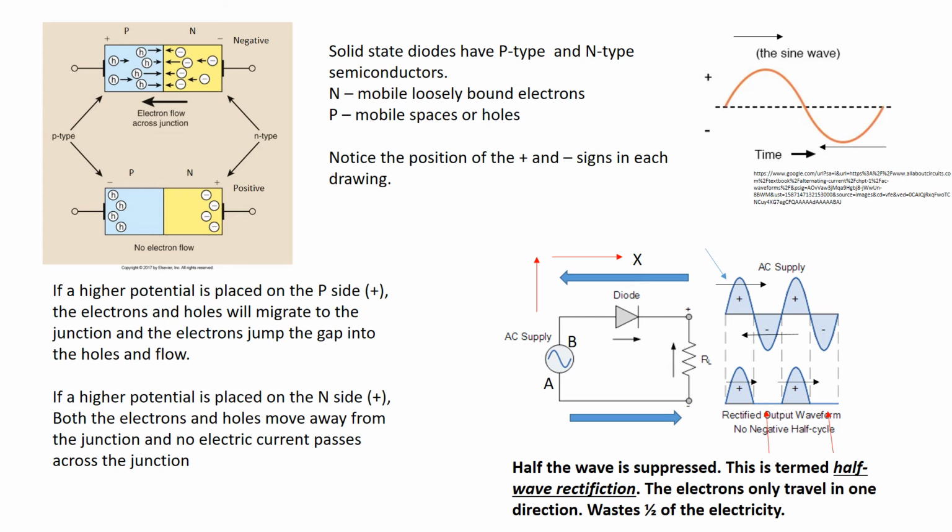And then look at the P junction, or P semiconductor. At the top, there was a plus. You see the P and then the plus. Well, now it's a P and a minus, negative. So our alternating current has shifted now, and now the N semiconductor is positive, or has a positive charge on it. The P has a negative.